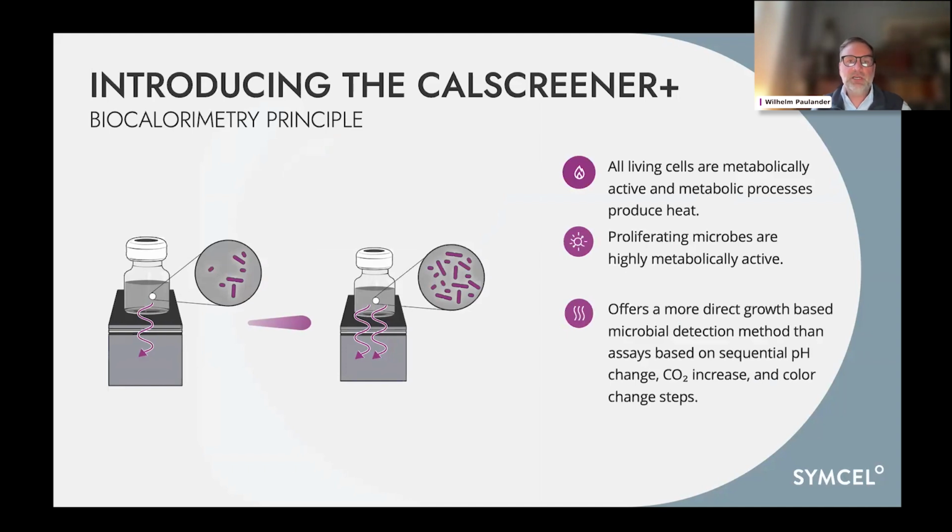That, of course, generates a higher signal, but it's not only related to the CFU or the biomass generated in the sample. Different microorganisms have different capacity to produce different metabolic output. And we will look into this a little bit in the coming slides, because it can explain why we can be so fast at detecting, for instance, slow-growing anaerobic organisms.